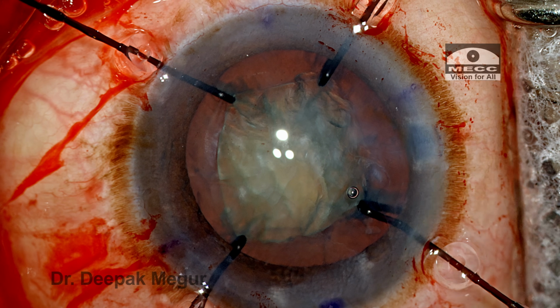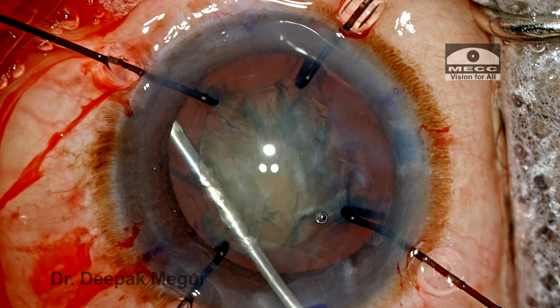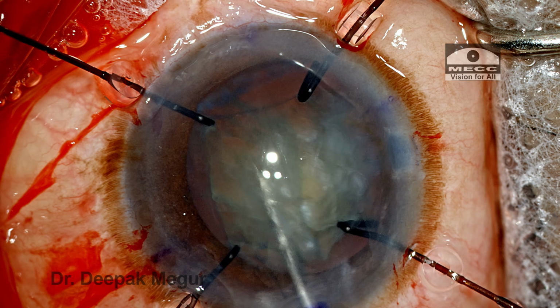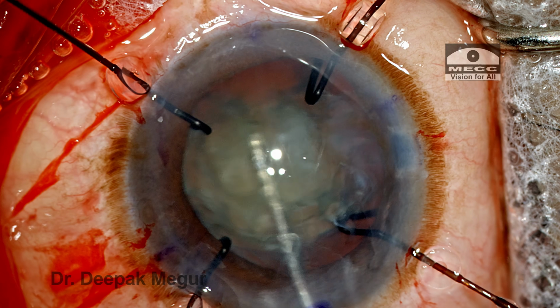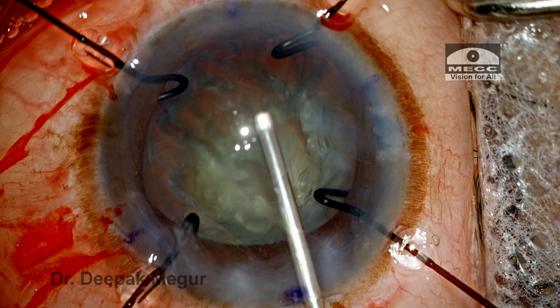Once the bag is stabilized, I want to redo the hydrodissection. With the bag being held taut, the hydrodissection would be much more effective. So now the corticocapsular adhesions are broken, the lens is freely mobile. Now is the time to perform the phacoemulsification.